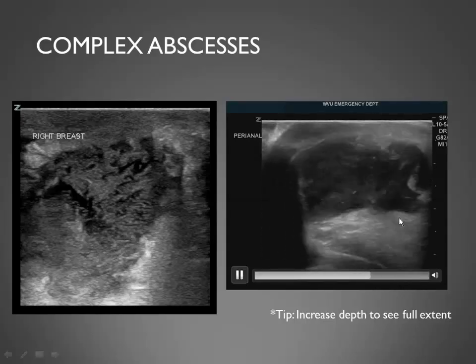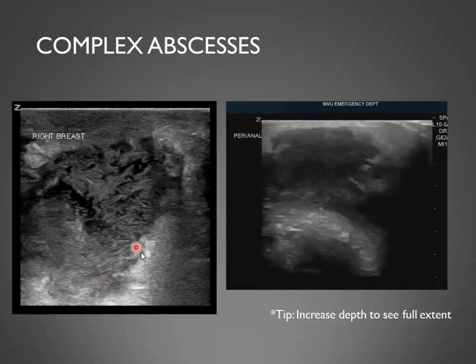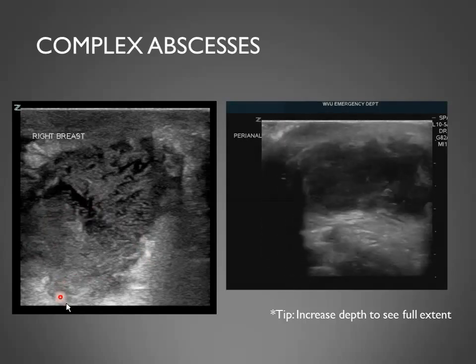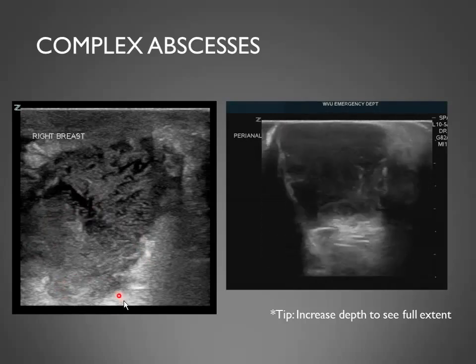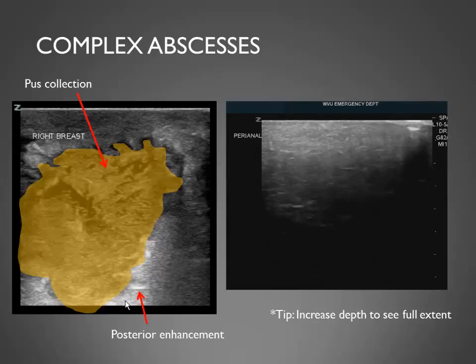And just a tip, this is a good example where we did it poorly. You want to increase your depth so that you can see the full borders and get a good idea of what's behind that abscess and really know how far it goes. And I'll try to outline that one there for you.